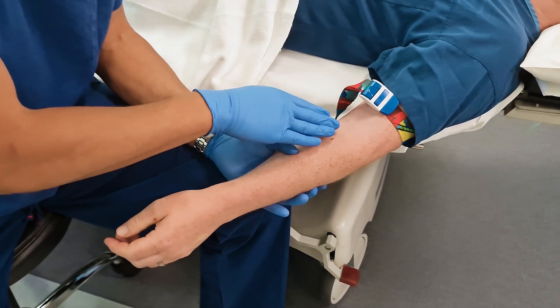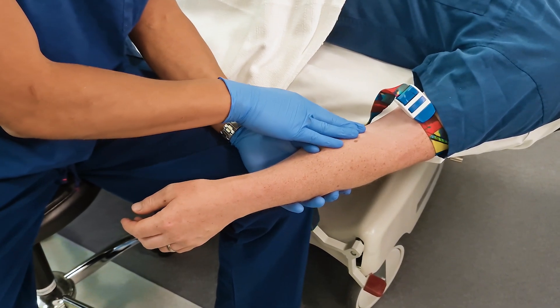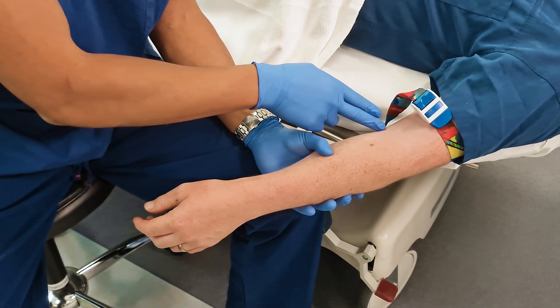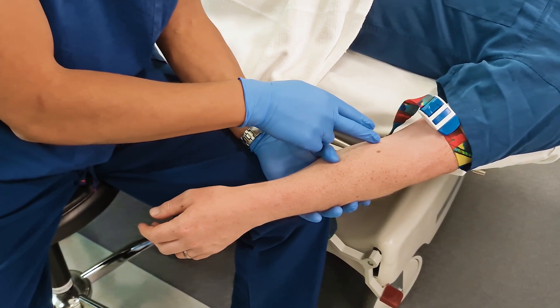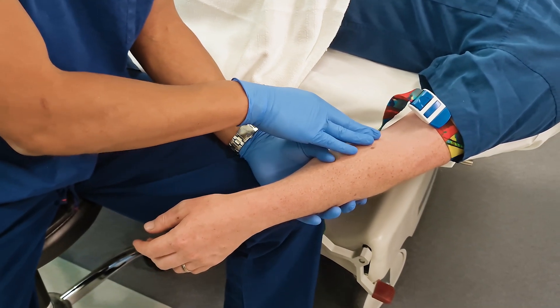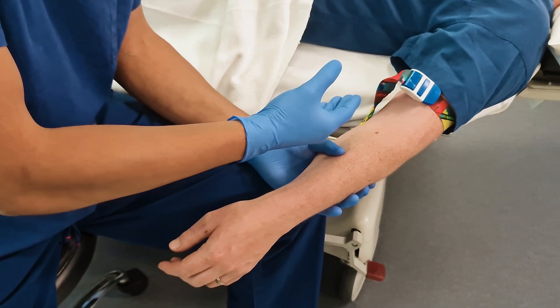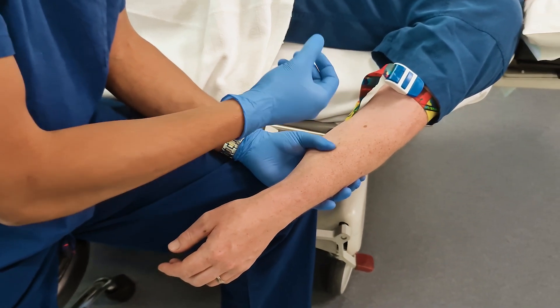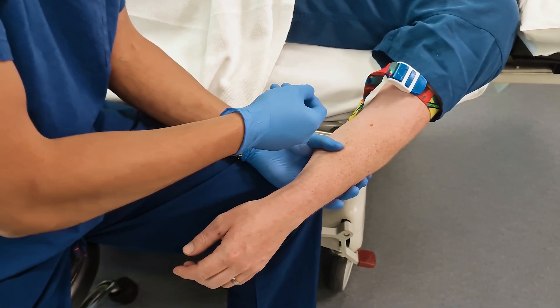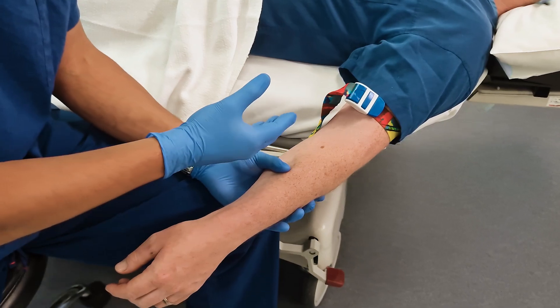Finally, one of the most common sites for blood taking and cannulation is the antecubital fossa. This spot is probably one of the first places you'll learn to cannulate, as the veins are superficial and quite large, making it quite an easy place to start out.